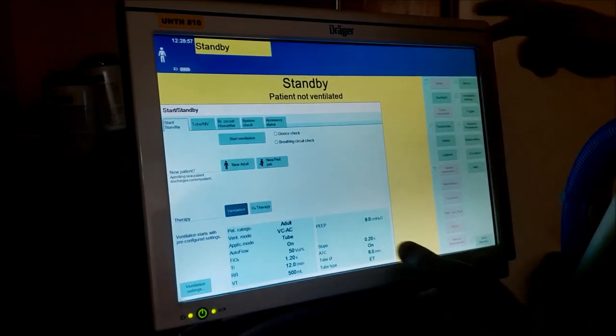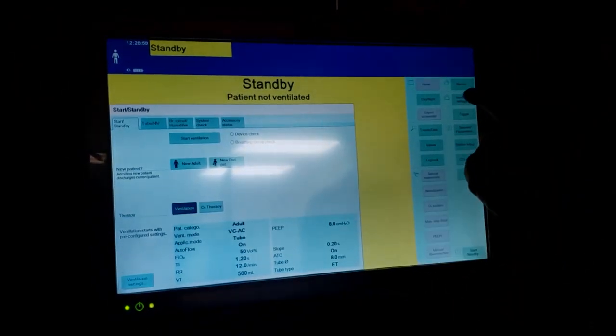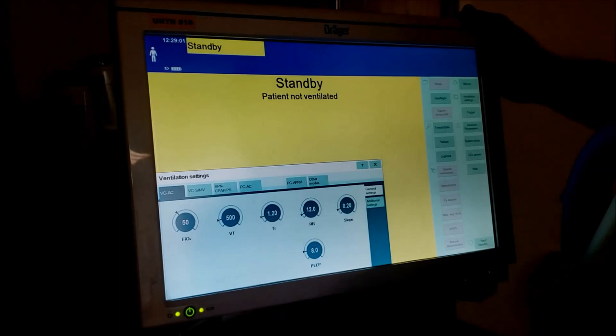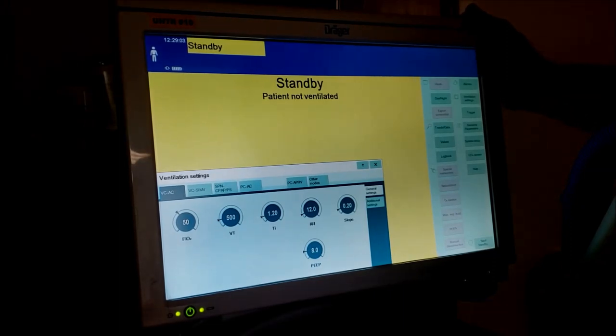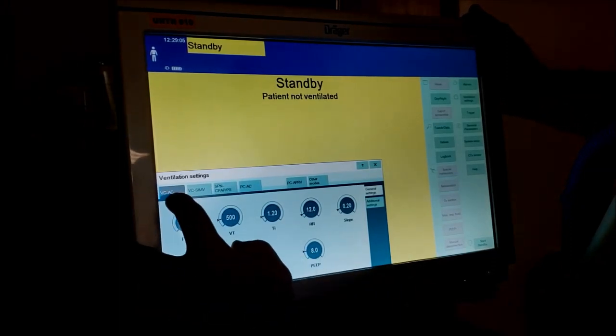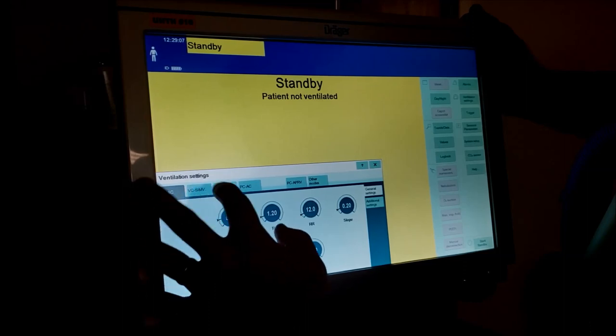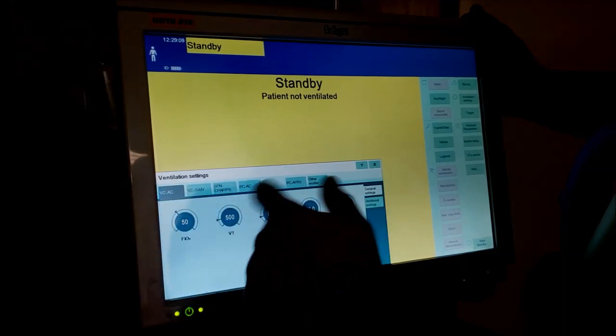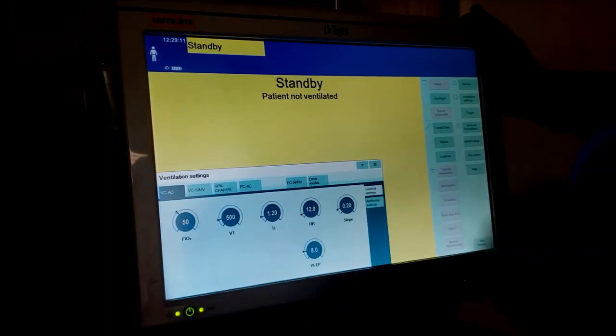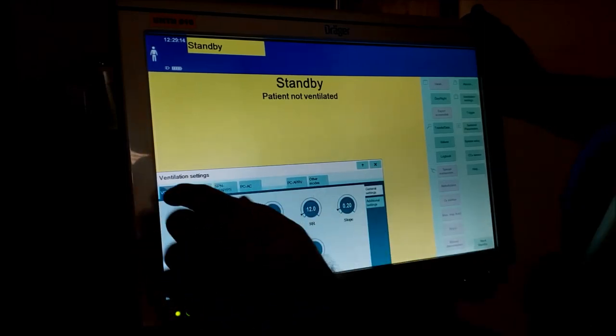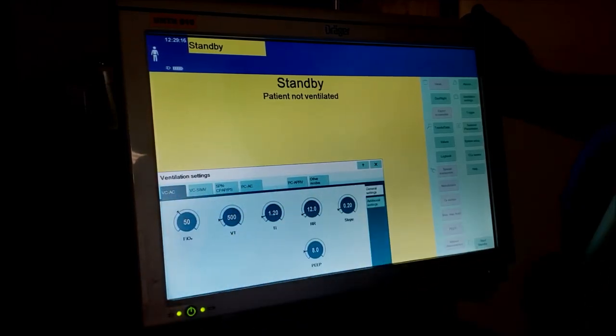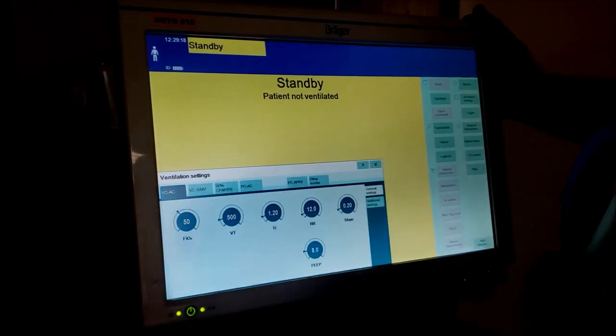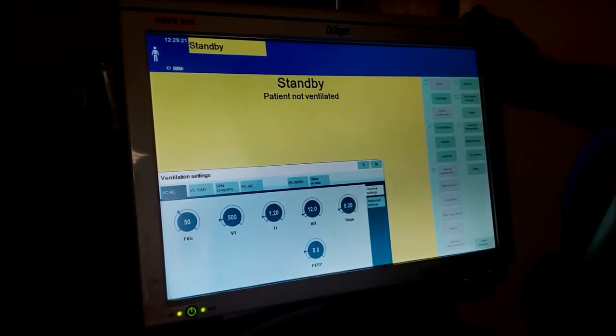Look over here on this side - ventilator settings. These are our different modes. To keep it really generic: VC AC, VC SIMV, SPN spontaneous CPAP pressure support, or pressure control assist control. Let's keep it easy and just do the first three. VC stands for volume control and AC stands for assist control.